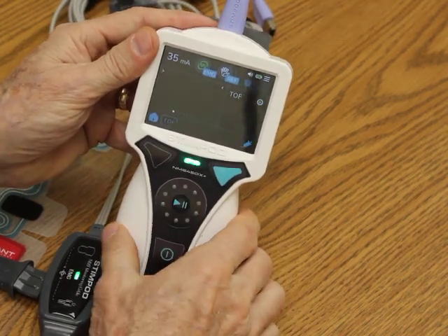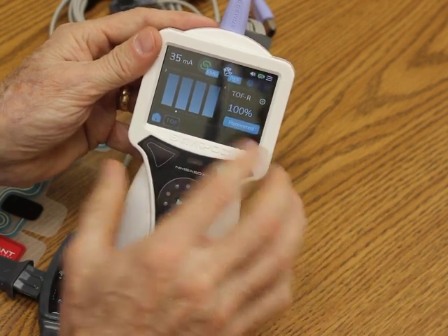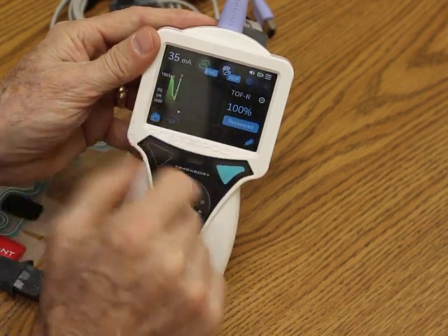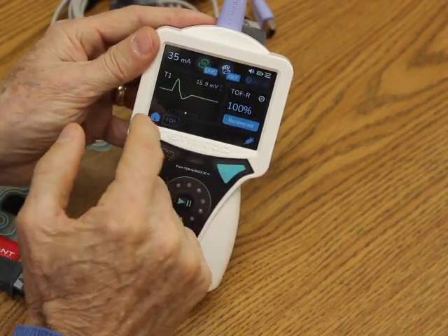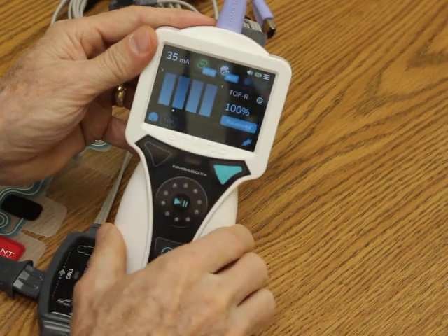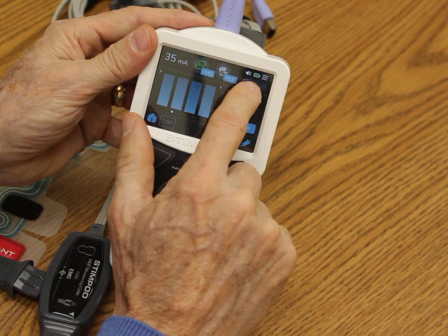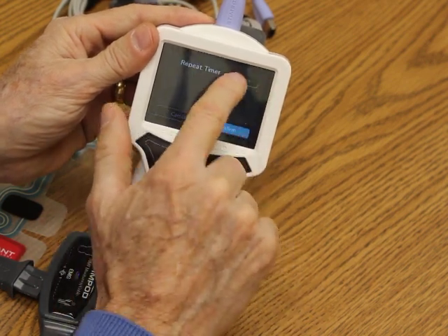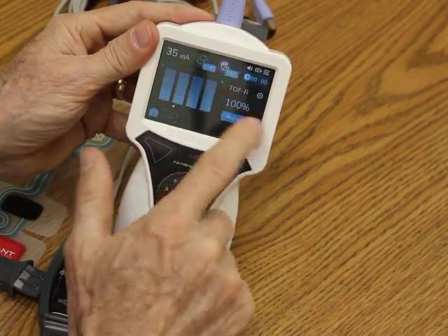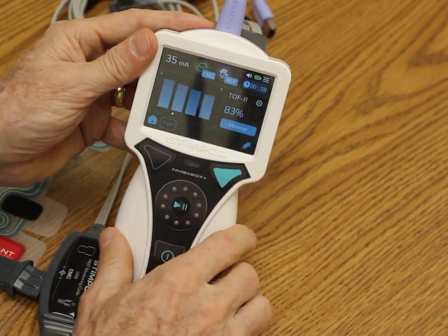In manual mode I would just do trains of four like this — it shows an example of 100%. If I swipe to the side I can show a trend, and I can put a drug marker there. I can see the waveforms — T1, T2, all four over top of each other — and then back to the four bar graphs. In manual mode it won't do a train of four until I tell it to. However, I can hit this little clock icon and turn the repeat timer on. I can choose every 30 seconds and confirm, so now it's going to take a train of four every 30 seconds. The touch screen really makes the Stimpod an easy device to use.